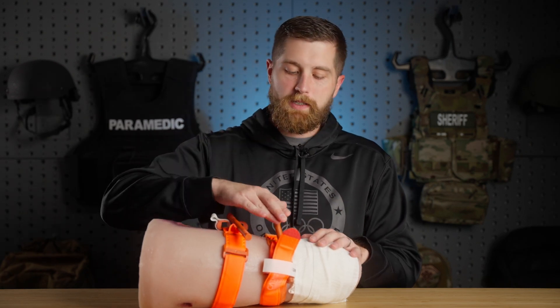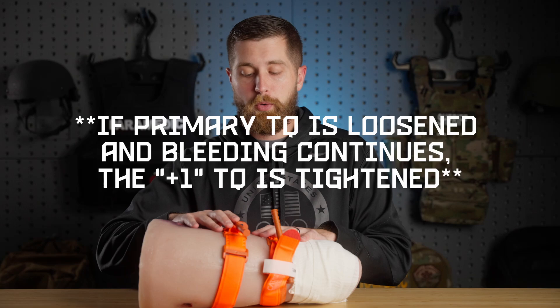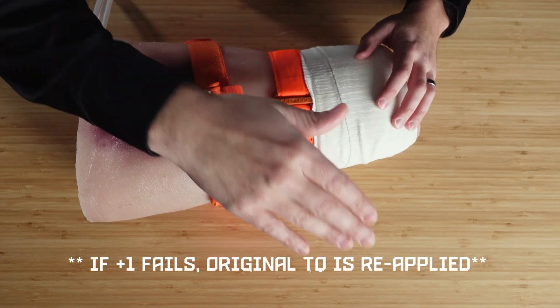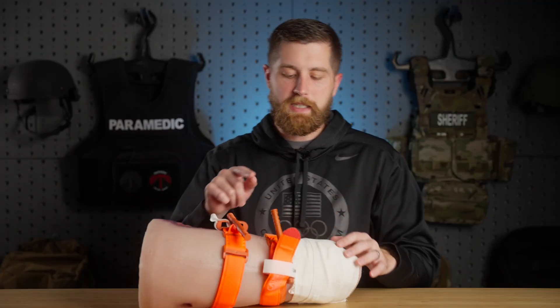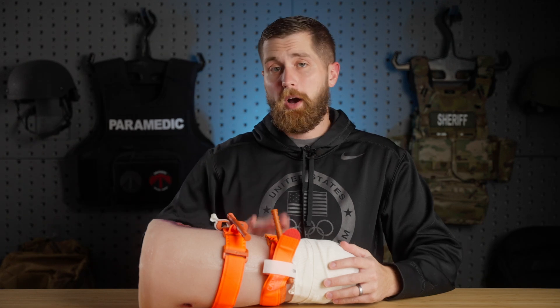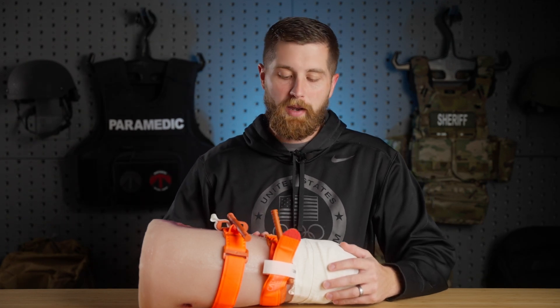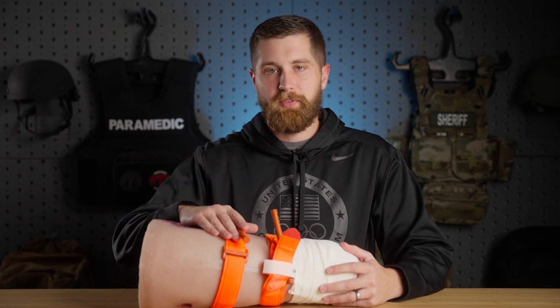If I loosen the original tourniquet and it starts to bleed, I'm going to tighten the plus-one tourniquet first before retightening the original — both stay in place. The reason for this redundancy is that CATs, and really any tourniquet, are technically one-time use. If one has been applied for a while, wear and tear on the material may cause it to break down and you might have a malfunction trying to tighten it back up. In my experience, the first tourniquet is oftentimes applied inappropriately or is a makeshift device like a belt, so it's better to have your commercial device ready to go.